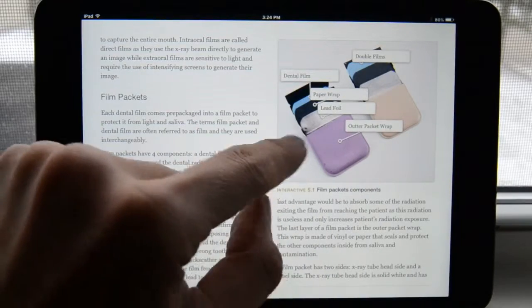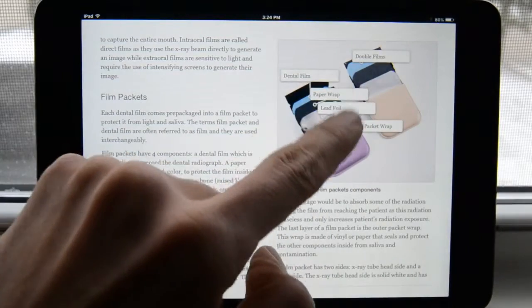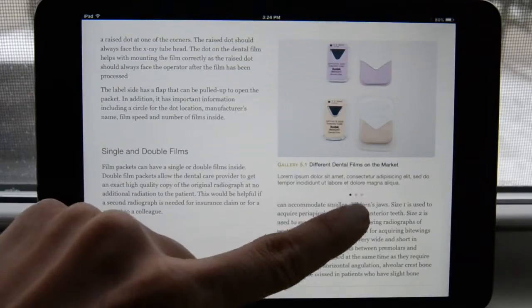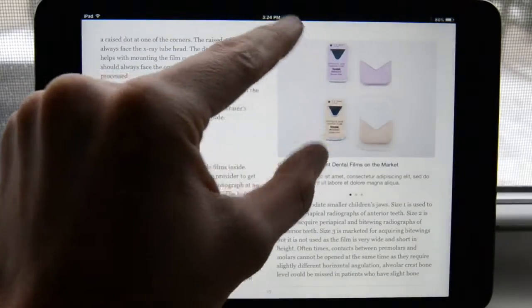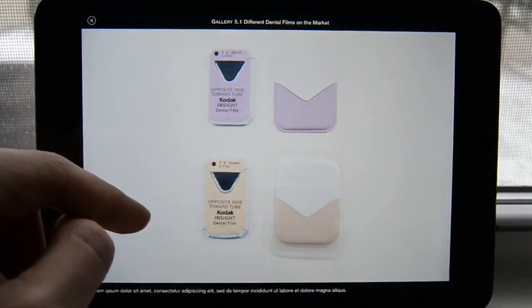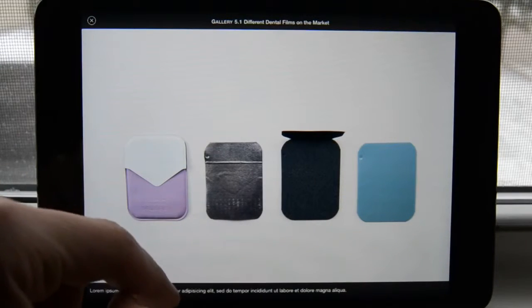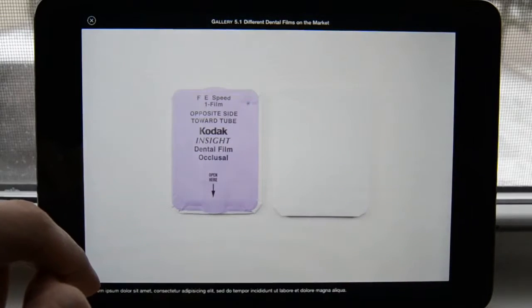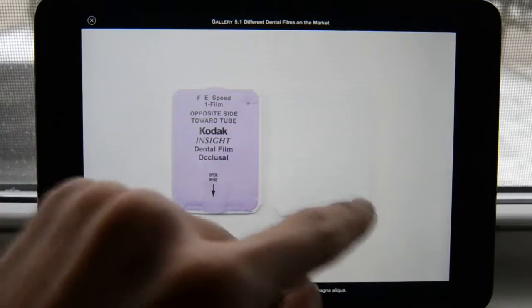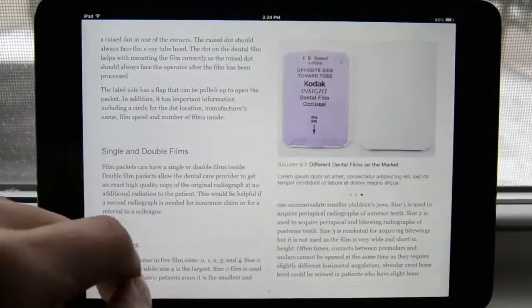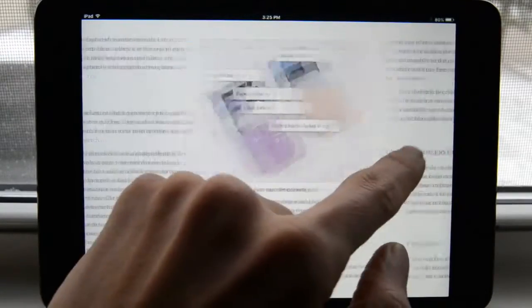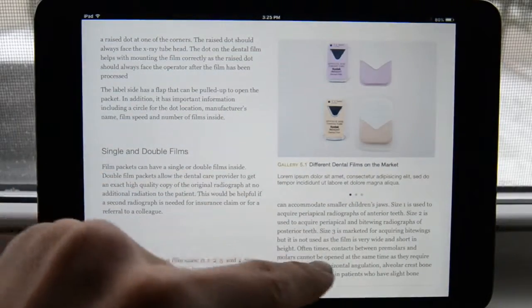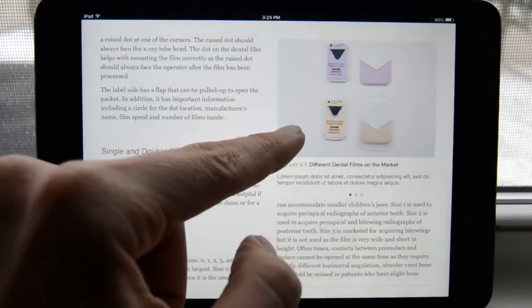We have a side-by-side comparison between a single packet film and a double packet, showing two films side by side. This is a gallery, so you can bring it up to full screen — we have a single film, double film, an unfolded layout of the components of a dental film packet, the size 4 film front and back. You can also navigate within a spot gallery, just swiping sideways, with those three dots representing the gallery.